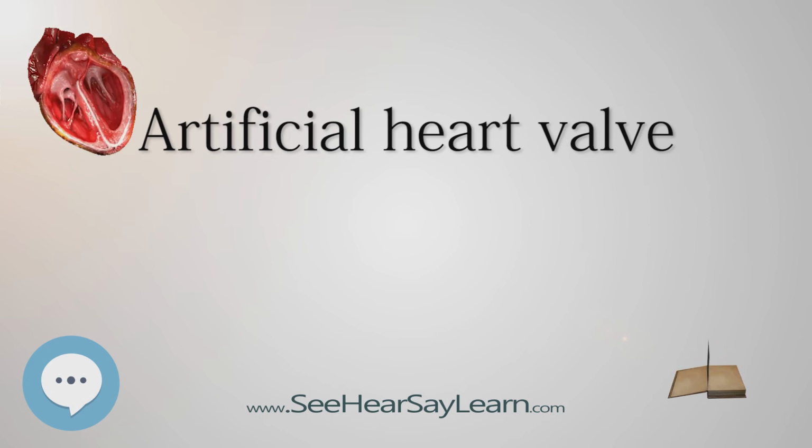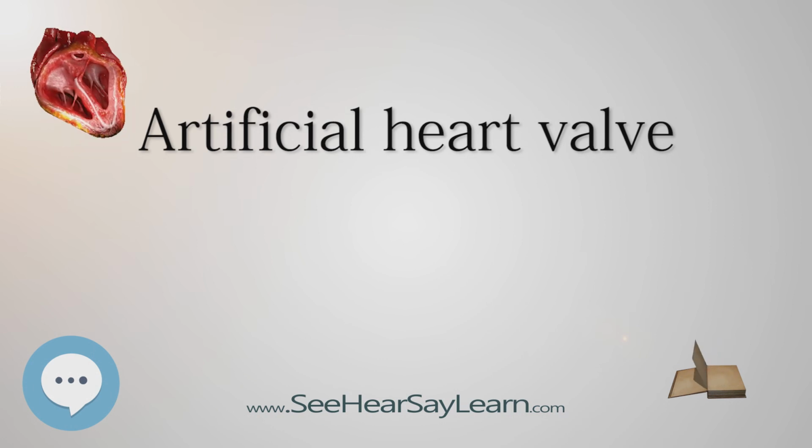Cavitation is the rapid formation of vaporous microbubbles in the fluid due to a local drop of pressure below the vaporization pressure at a given temperature. When conditions for cavitation are present, bubbles will form and at the time of pressure recovery they will collapse or implode. This event will cause pressure or thermal shock waves and fluid microjets which can damage a surface. These thermodynamic conditions are known to be the cause of MHV-related erosion. The valvular event that causes such cavitating conditions to exist is the closing mechanics of the MHV.